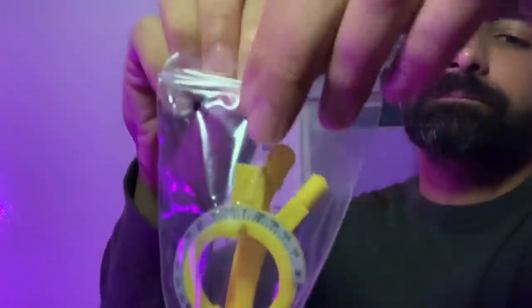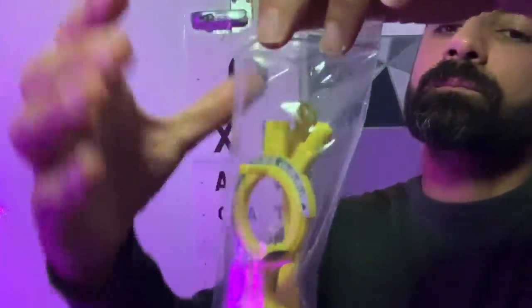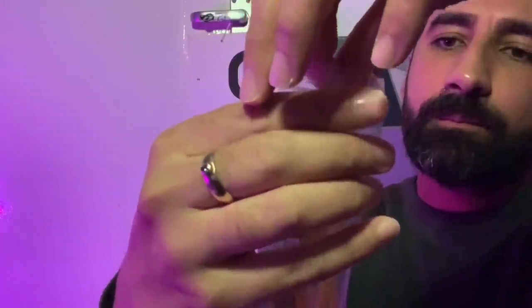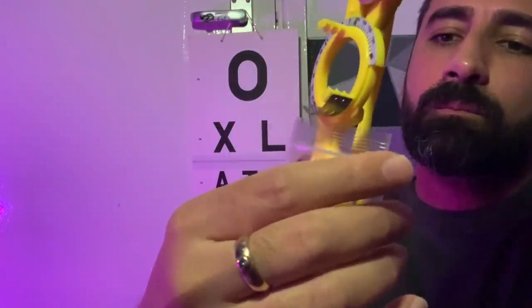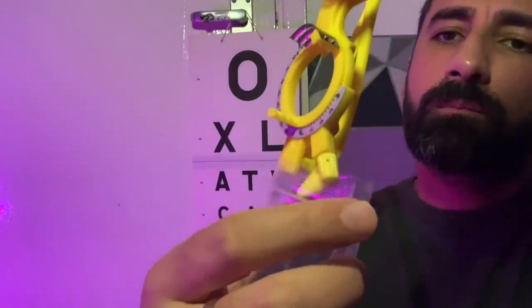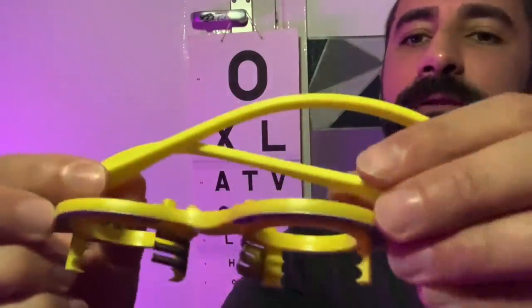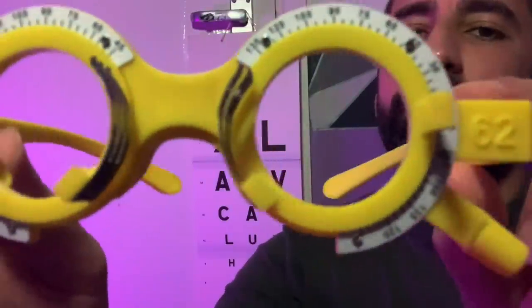Let's take the frame out of the case for you. You have to be very delicate, very careful. Here is your brand new yellow trial frame for your refraction. So we'll pop this on in a moment. We'll perform some retinoscopy, with or without the lens, some lens one or two. Lens one, lens two. Have a little look. There is your new trial frame.